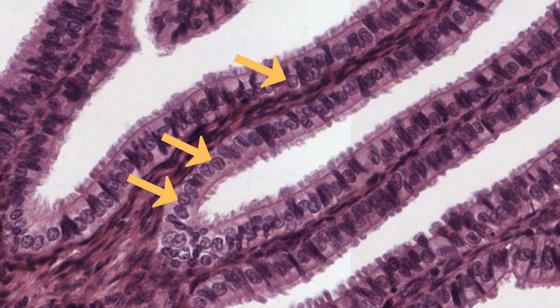Look at these nuclei. They're rounded, and so are their cells. Some cells adjacent are elongate, indicative of columnar cells. They're called peg cells. Another feature of ciliated epithelium you can clearly see in this image is the dark line immediately under the apex of many of the epithelial cells. This represents the basal bodies anchoring each cilium into the apex of the cell. They do look similar to the terminal web supporting microvilli, but microvilli are much smaller than cilia.